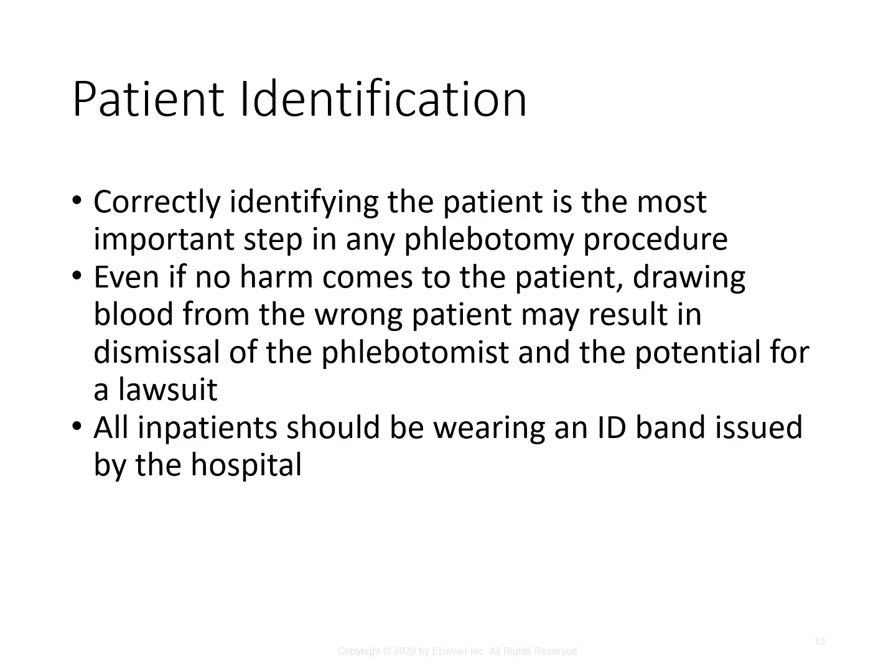Guidelines issued in 2010 by the Joint Commission indicate that at least 2 patient identifiers must be used to correctly identify a patient before drawing any blood. Although 2 patients in a hospital may have the same name and even the same date of birth, they will not be assigned the same ID number. So the ID number must match the number on the requisition. You may be required to ask for other confirmatory information, such as a picture ID, so make sure you check your institution's policies.